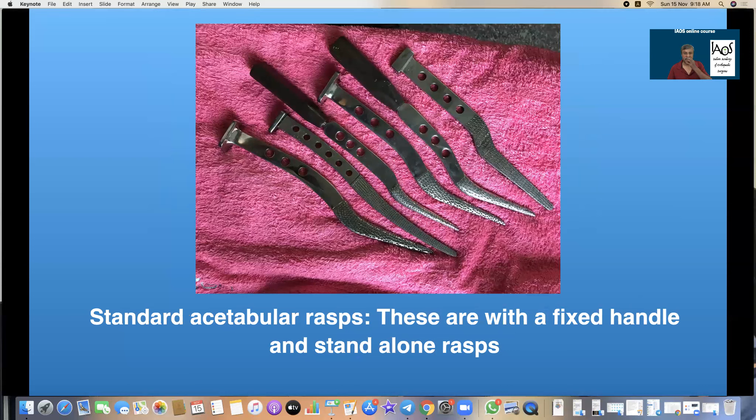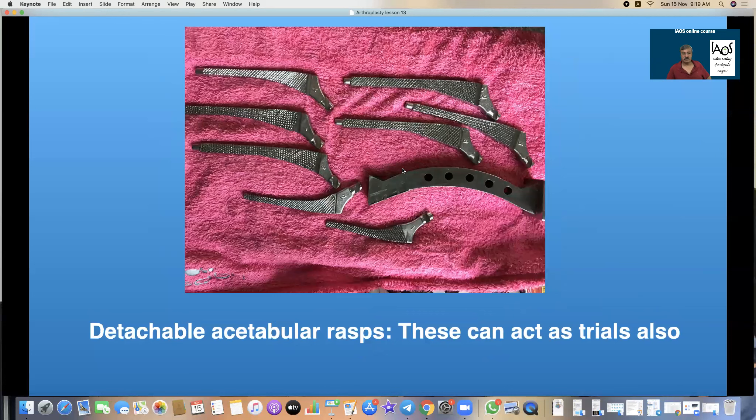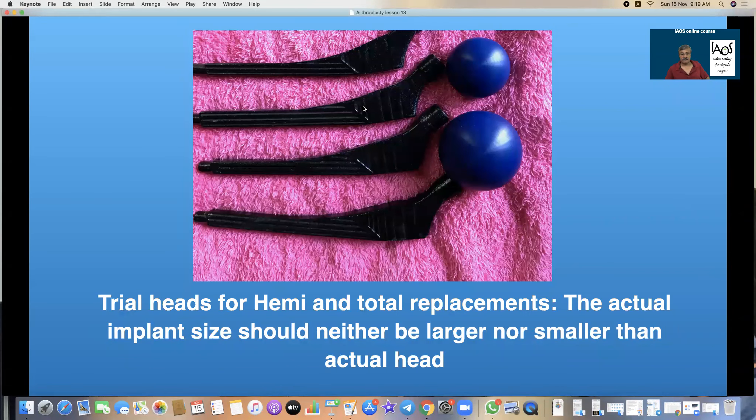These are fixed handle rasps of the traditional type, right from Austin Moore to original cemented Charnley. These rasps are useful for rasping the medulla and producing a cavity suitable for the prosthesis. These are detachable femoral rasps which are rasp-cum-trial instruments, meaning you attach a handle, hammer it inside, and then attach a head ball on the rasp to do a trial reduction. If you use this rasp-cum-trial design, you do not need separate trial prostheses.